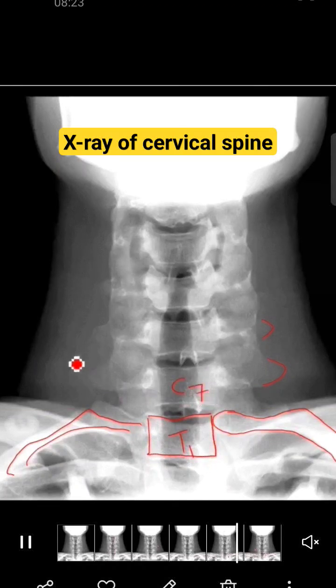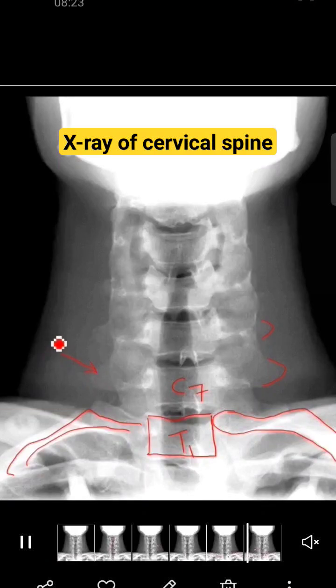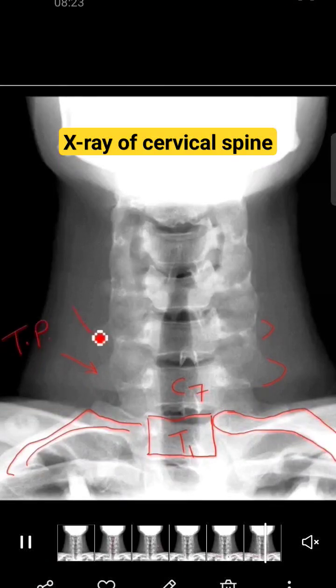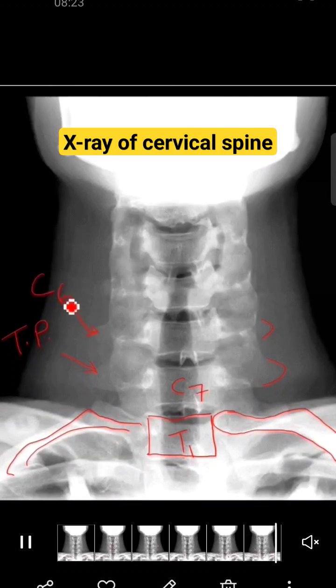Above T1 you will have the seventh cervical vertebra. So these projections are transverse processes projecting on the side — this is the C7 transverse process, and this is the C6 transverse process. Thank you.